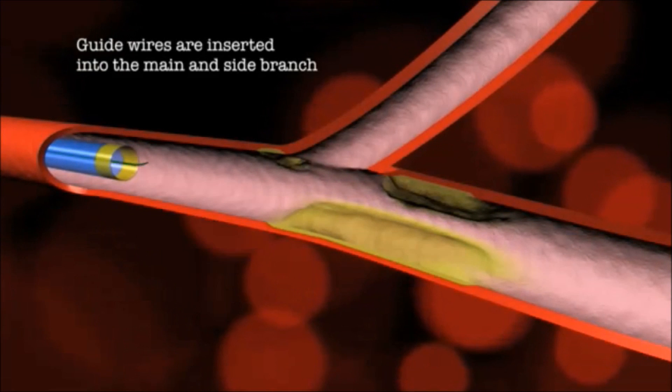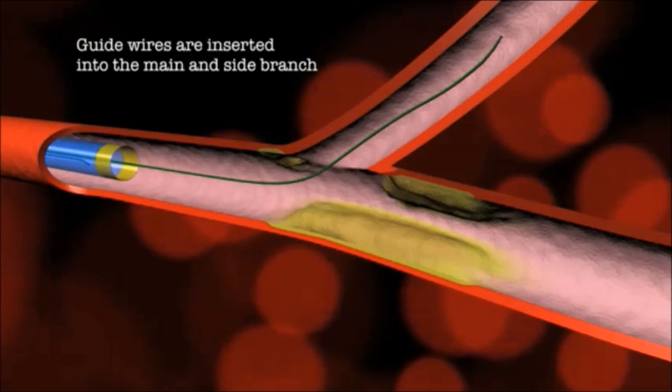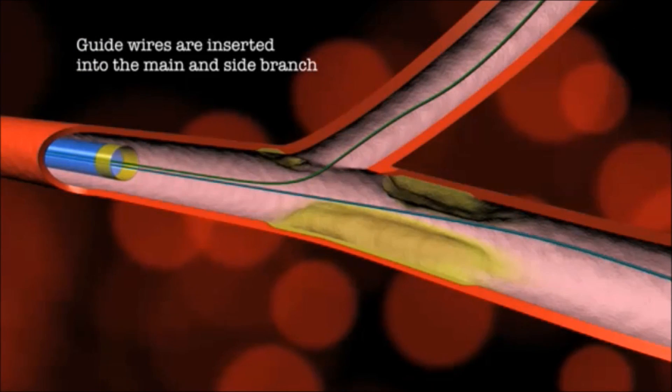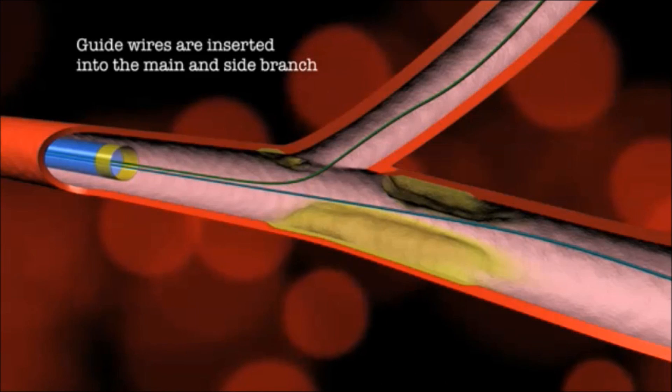The simplicity by which the ABS bifurcation stent is placed is demonstrated in this animation. The device consists of an independently movable dual catheter system.